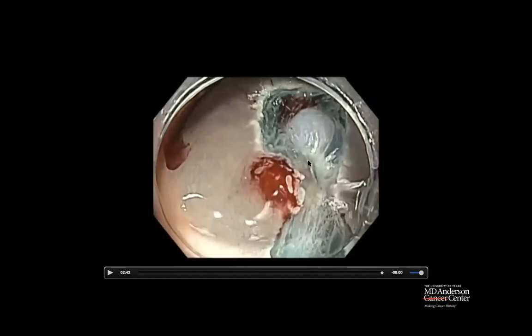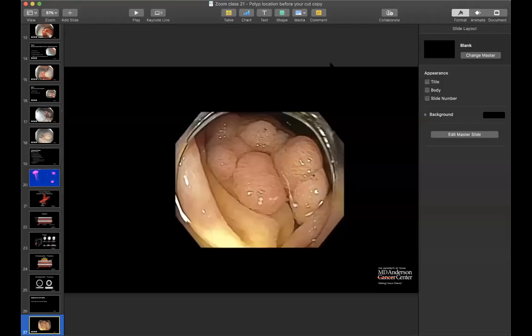So I brought this case to show you two examples. One where I struggled because of not realizing the importance of a polyp in a dependent position, and another one where we applied the principle. So why don't I stop here and we can have some questions and let the panel bring out some questions so that we can discuss this further.